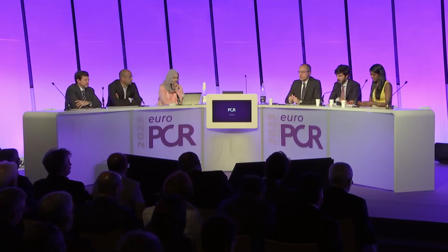There are two aspects that I'd like to discuss with you at this stage. The first one is the technique applied for rotational atherectomy. It was a compendium of tips and tricks. And the second one is the degree of plaque modification achieved after the 1.5 and 1.75 millimeter burr. Let me start with Antonio. The technique in general, but in this specific case where we have a long calcified lesion, what should be done to have a proper rotational atherectomy technique?